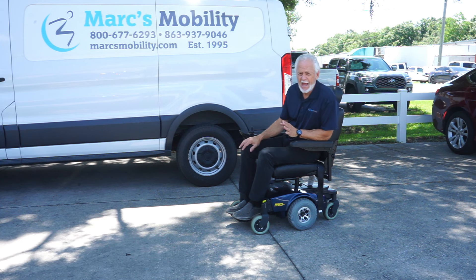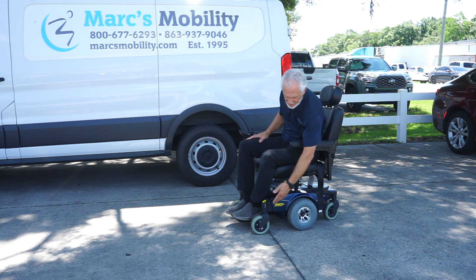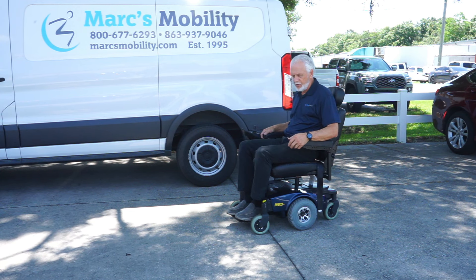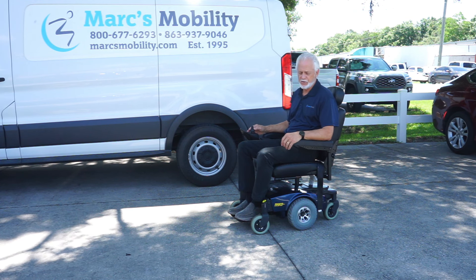So this is a Pronto M51 — the one with the rear wheels set in, solid tires, that nice suspension in front, swivel seat, flip-up arms, and the built-in charger in the back. Just a proven, proven power chair.